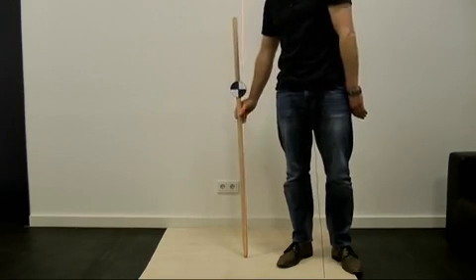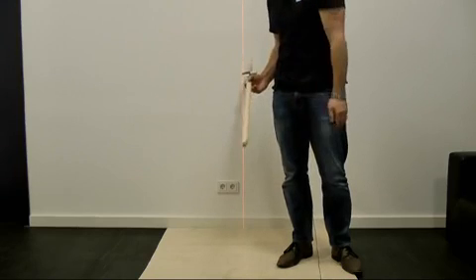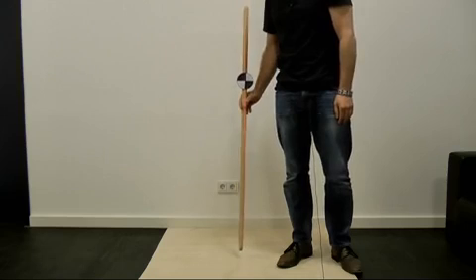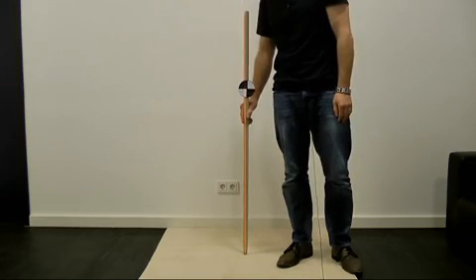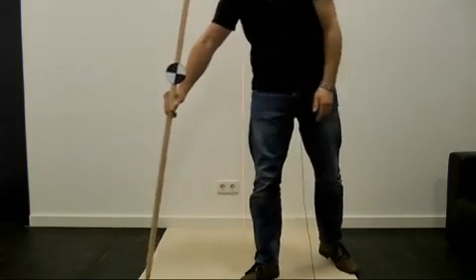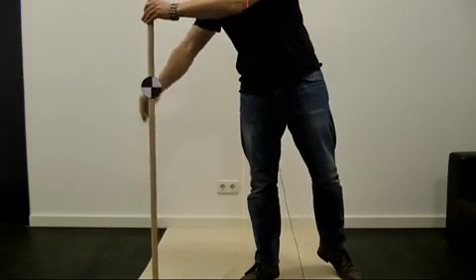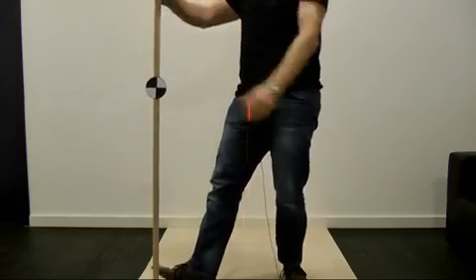Now, the solution for this problem is obvious. We have to increase the supporting area, and that is exactly what we will do. Here we would do it also for our patients. We are showing how we increase the support area available to them. Here it is simulated by a cardboard shoe.